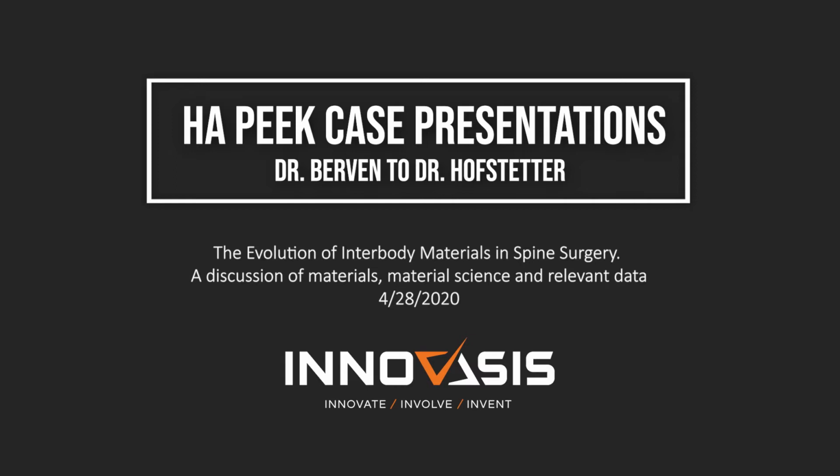I have to say that I'm pretty aggressive in reducing basically the subluxation of the disc space. So I use these disc spreaders in the cervical spine and really reduce the height quite aggressively. And while the patients do have a couple months of mid-scapular pain with that, I feel that it's worth it because you can restore the anatomy. And so once the graft goes in, it's pretty loose. I think there was one thing I tell my fellows and my residents all the time.